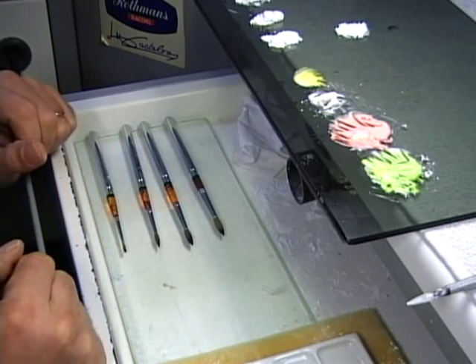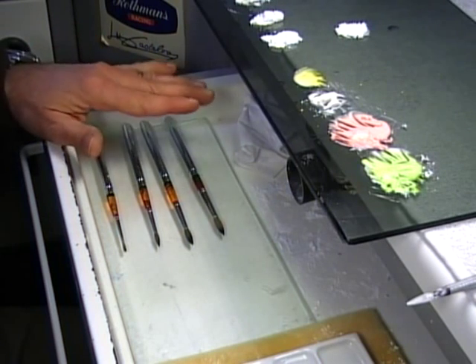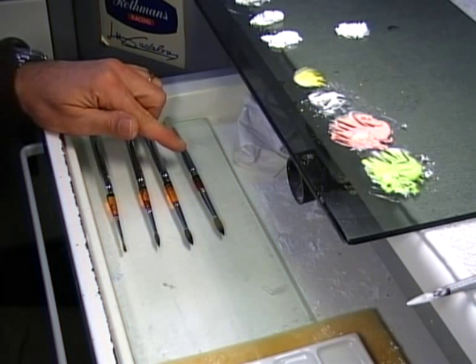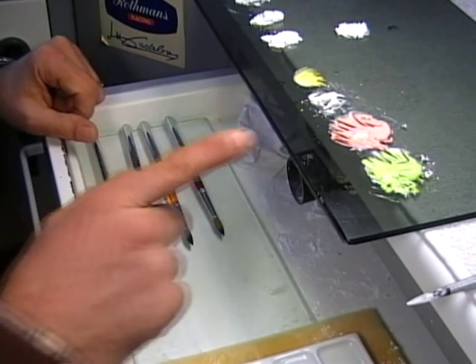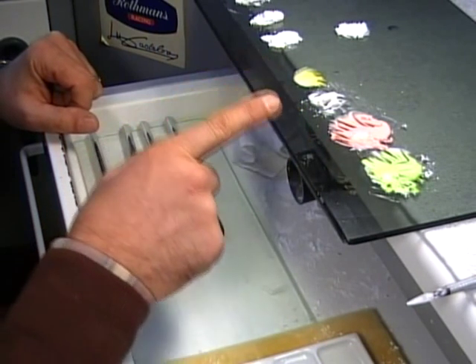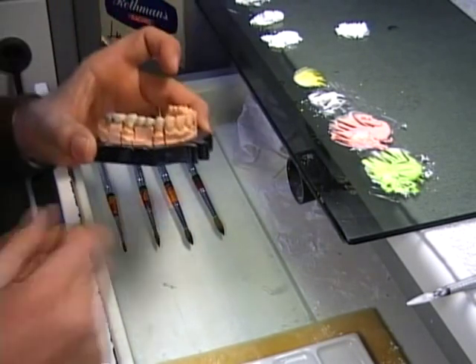Now we will proceed with the build-up of this porcelain bridge. I have set already my brushes inside my drawer and I have a position so you can recognize what I am using: number eight, number six, number four, number two. I have mixed my porcelain — A2 opacious, A2 body, D2 plain, D2, D3.